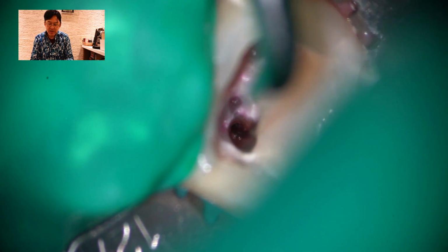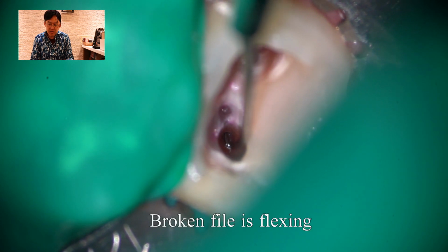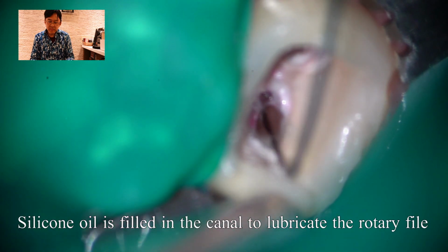Because the length of the broken instrument is longer than 4.5 millimeters, it is expected to take time. So now you can see the instrument flexing, not dancing, because it goes back to the original place. So more silicone oil is injected into the root canal.